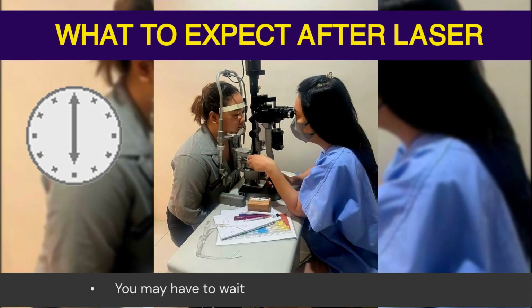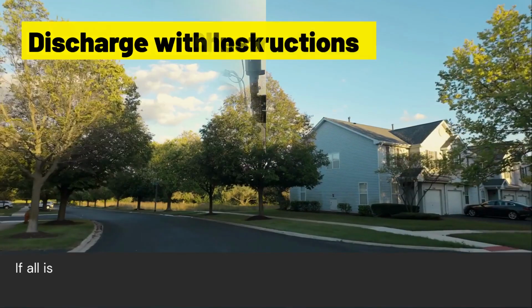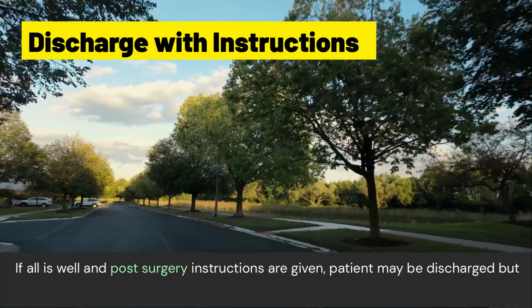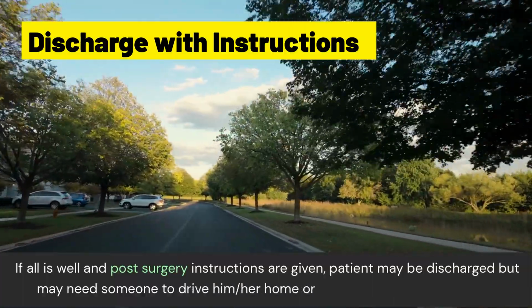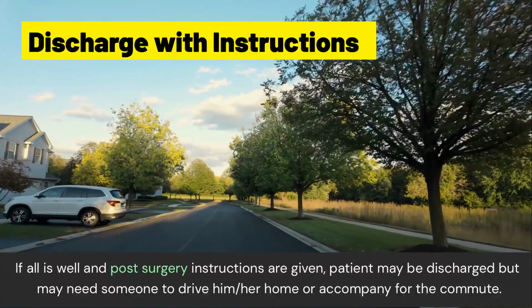So these are some of the things to expect after a laser. You may have to wait in the doctor's office for an hour, and the reason is to check for eye pressure. If all is well and eye pressure is normal after an hour, post-surgery instructions are given and the patient may be discharged, but she or he may need someone to drive them home or accompany them for the commute.